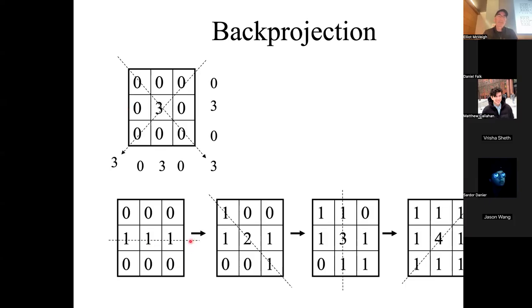So we do that. And so our first estimate from this set of measurements is that we project the 0 back, everybody's 0. We project 3 uniformly across there. So I get 1, 1, 1, and project these back and everybody's 0. So that's our first data point. Now let's take, who goes next?